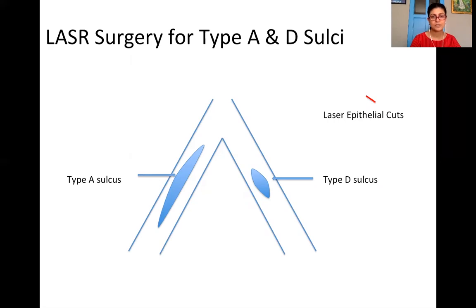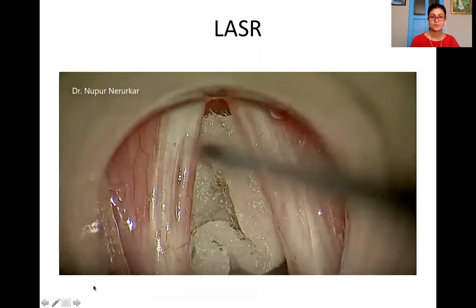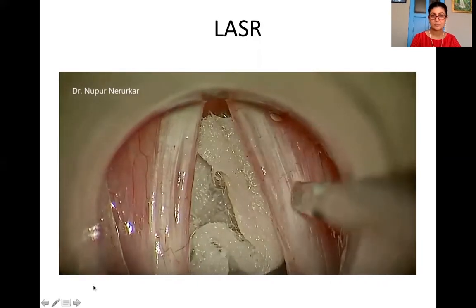The surgery was performed with a CO2 laser in scanning mode. The AccuBlade was used with a length of 0.3 to 0.5 millimeters and a depth of one, which is 250 microns. Cuts were made at 90 degrees to the lip of the sulci so as to release them. Whether type A or type D, we also operated bilaterally. Here is a short video clip to demonstrate the surgery being performed.